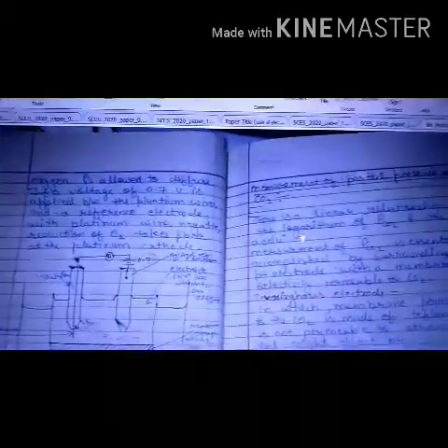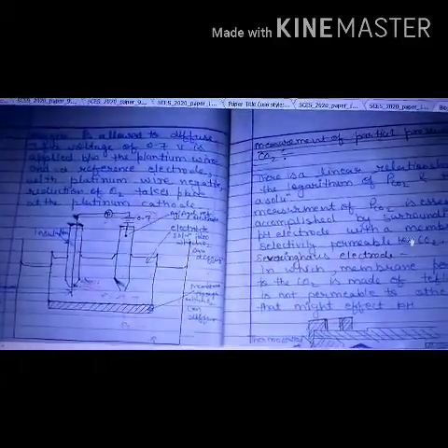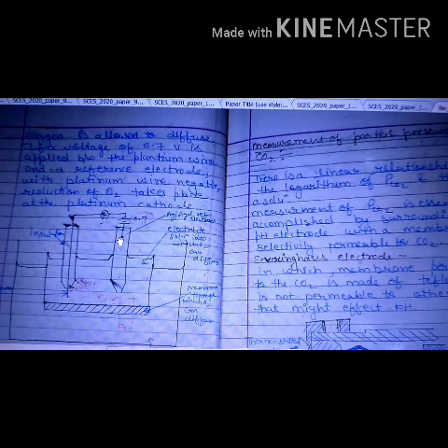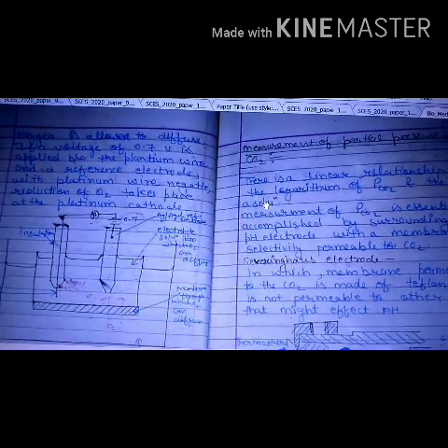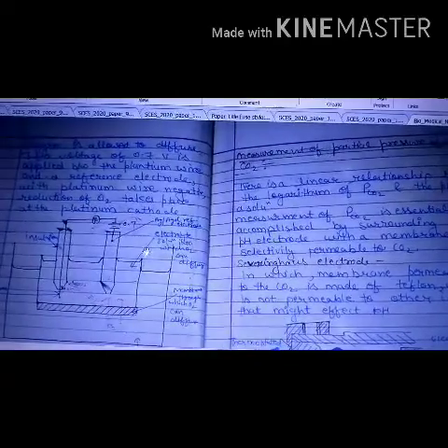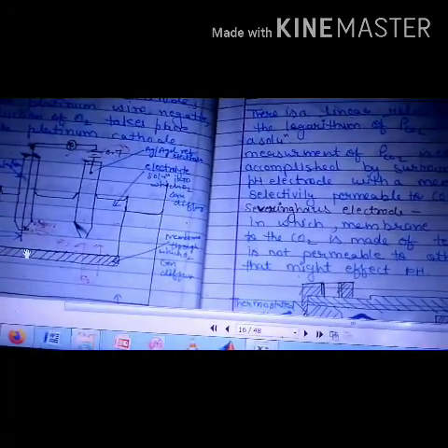So this is the setup which has been shown, in which this is the AgCl reference. This is the electrolyte solution in which our O2 can diffuse. Now this is the membrane through which O2 will diffuse. So this is a semi-permeable membrane for oxygen gas. And this is an insulating electrode here with a platinum tip. So this is a platinum electrode over which we have provided an insulation.